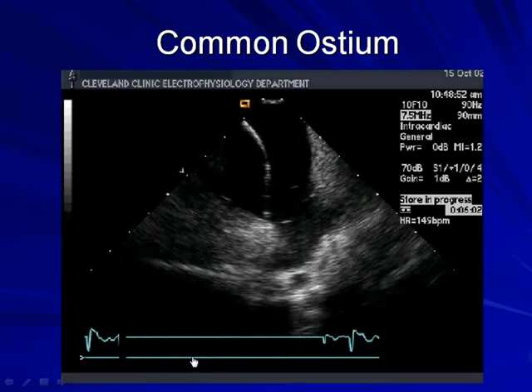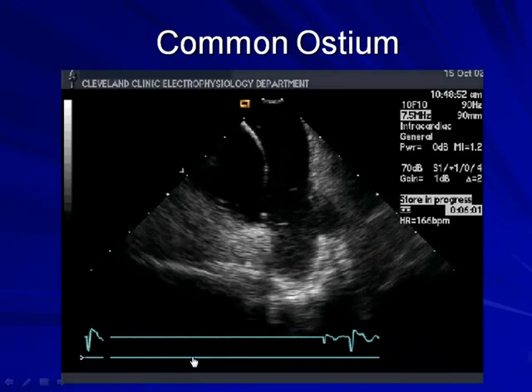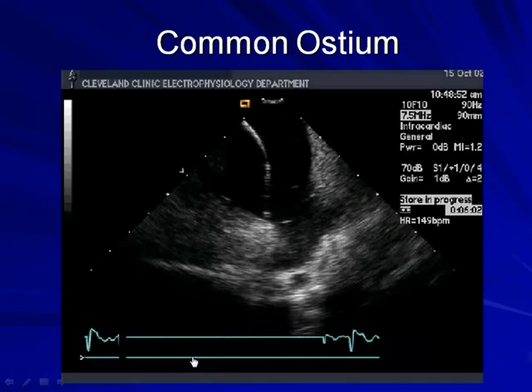Okay. So my point here is that in this particular case, and this is a different patient from before, you have a lasso that's sitting at the left common, with branching from the veins. If you didn't appreciate that it was a left common, which is only a variant of perfectly normal anatomy, you'd be tempted to isolate these veins fairly far inside the vein, in the venous structure, greatly increasing the risk of injury, and potentially not isolating the bulk of the tissue that's actually the trigger for the atrial fibrillation.